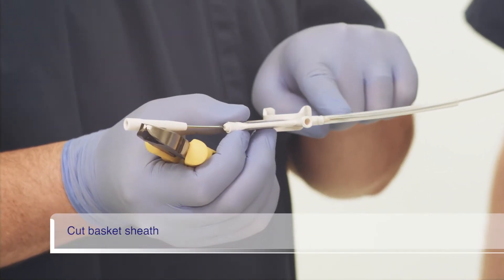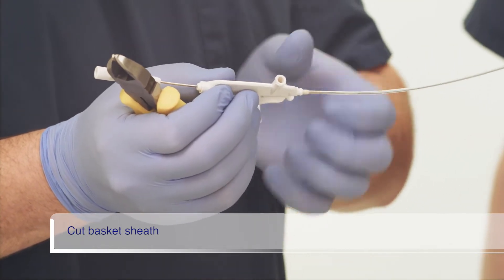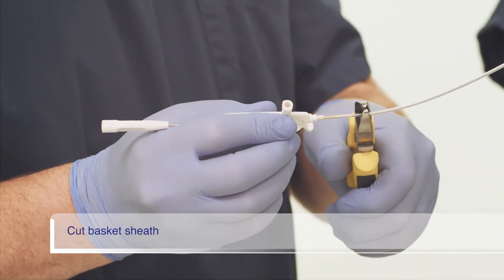To accomplish this, slide the plastic sleeve located at the handle away from the handle. Then, using the wire cutters, cut the sheath close to the handle.